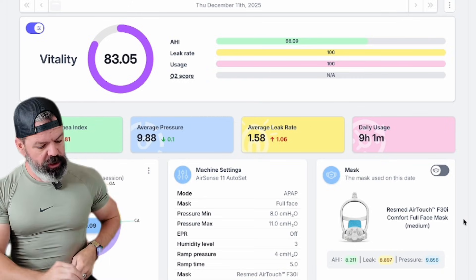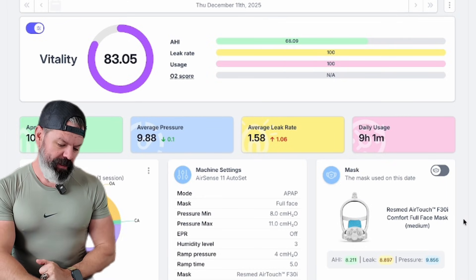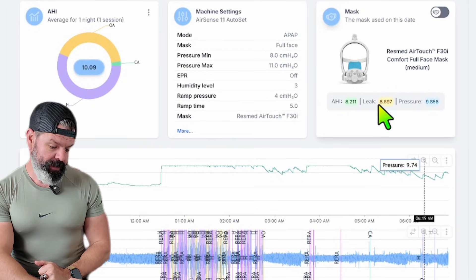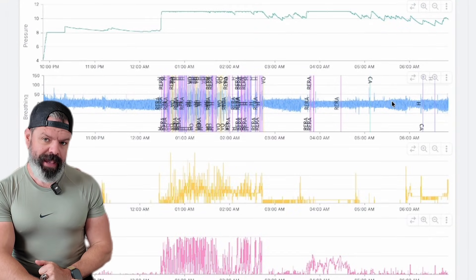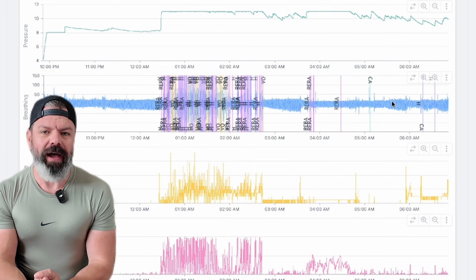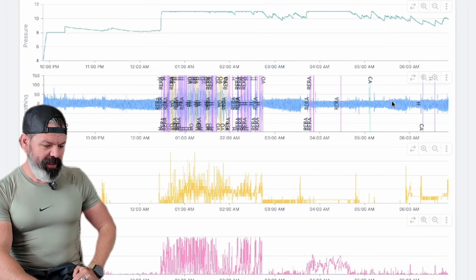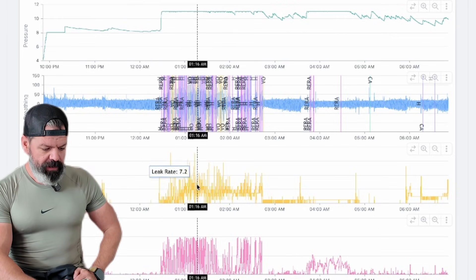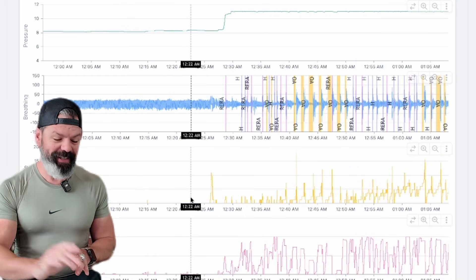Let's grade some SleepHQ profiles, shall we? Starting with Alan. Here's the AirTouch F30i, average leak nine. I'm going to give this a grade of A. You might be thinking, why would you give that an A? It's actually not the mask's fault on this occasion. You can see here there's all this leak, but all this leak is caused because his apnea isn't treated.